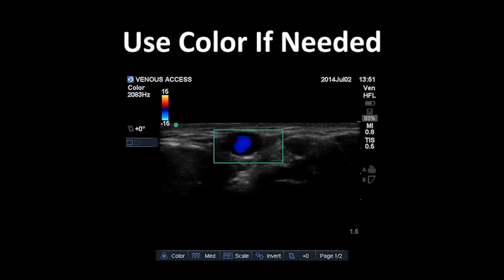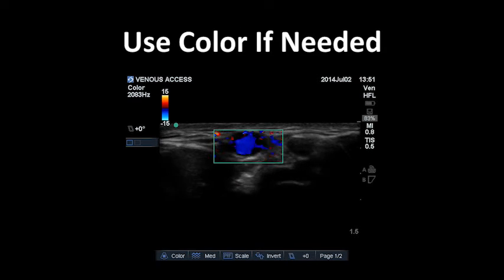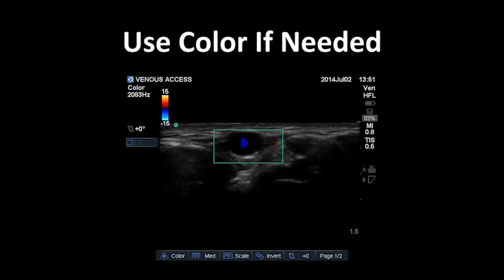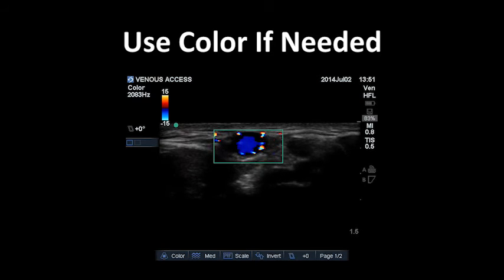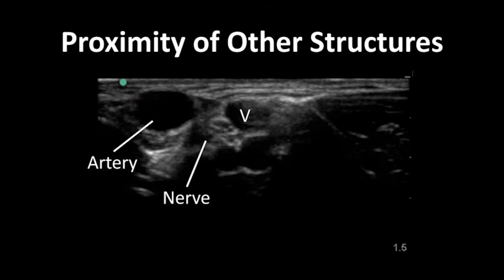Remember, red and blue simply mean towards or away from the probe respectively, and do not signify an artery or a vein. Use the ultrasound to check the position of your target vein in relation to nearby structures such as arteries or nerves. Ideally, you will choose a vein that has a clear pathway from skin to the vessel surface, which is not near an artery or a nerve bundle.